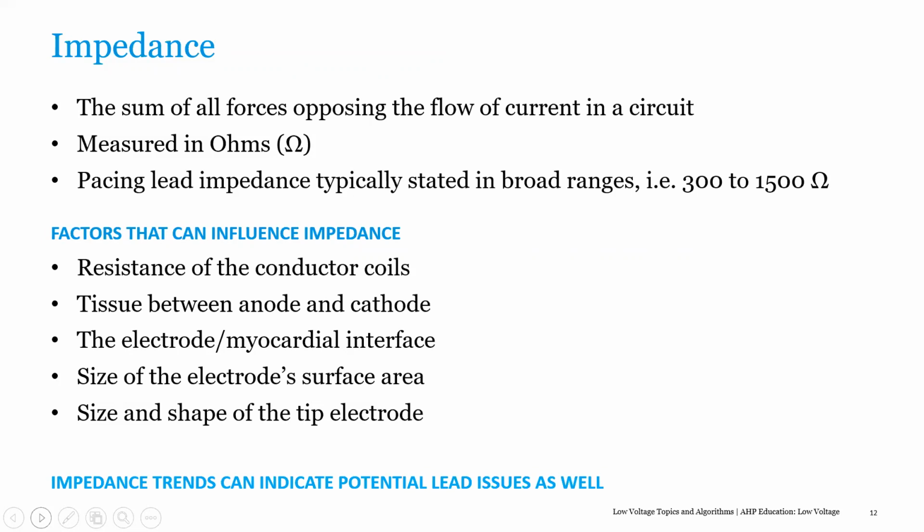If they fall outside of those parameters, we start looking for problems, because the lead is in constant motion, okay? It's the only moving part to this pacemaker system, and it's more susceptible to failure than anything else in the entire system.